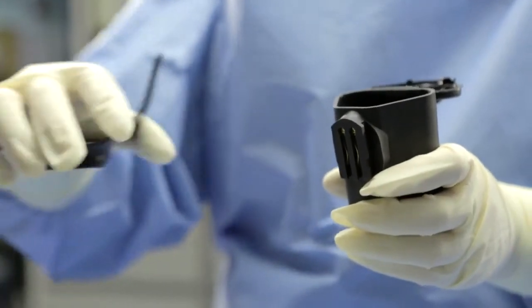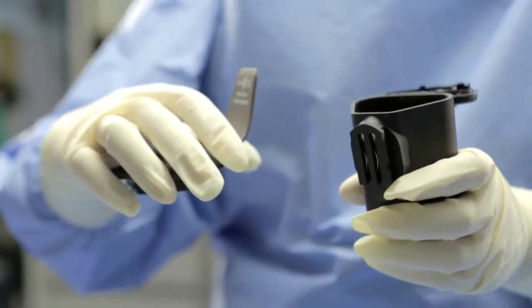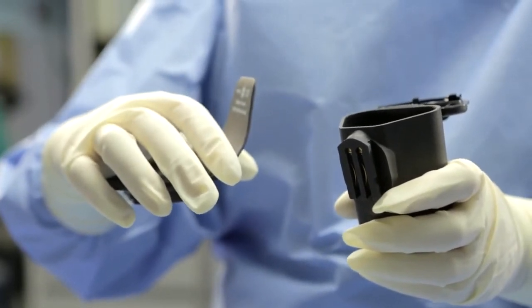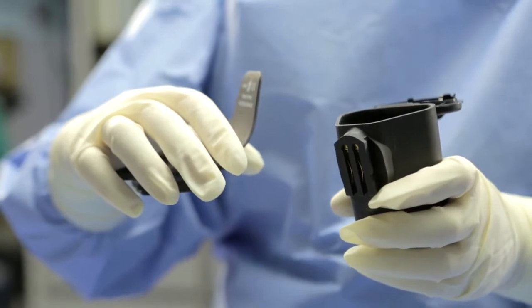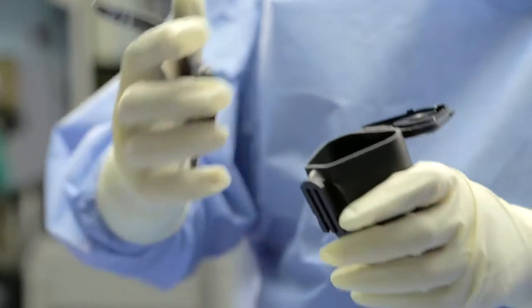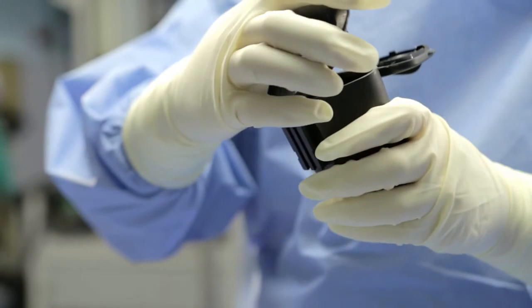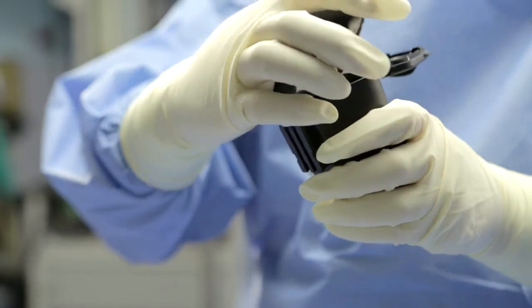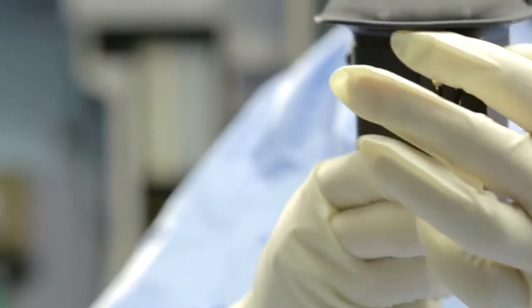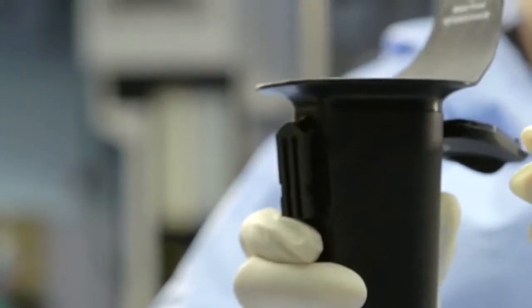Hold the battery housing in your hand so that the open door of the battery housing is facing the scrub. Hold the transfer sleeve so that the opening of the sleeve is pointing down and the long part of the sleeve is oriented closest to the scrub. Place the front of the sterile sleeve into the battery housing, paying close attention to the ridge that seats the sleeve upon the housing. Drop the back of the sleeve into position slowly and ensure that the connection is secure all the way around the battery housing.